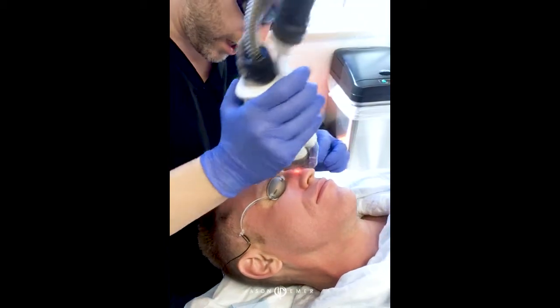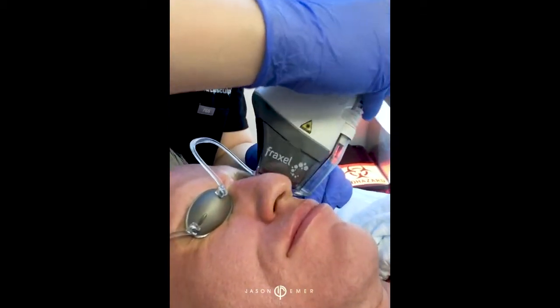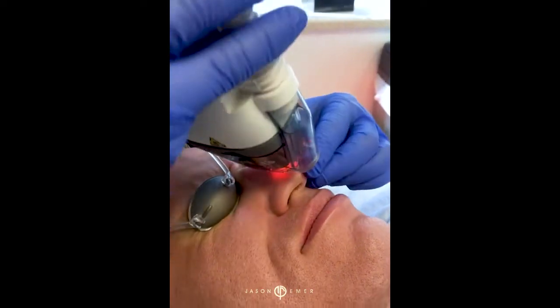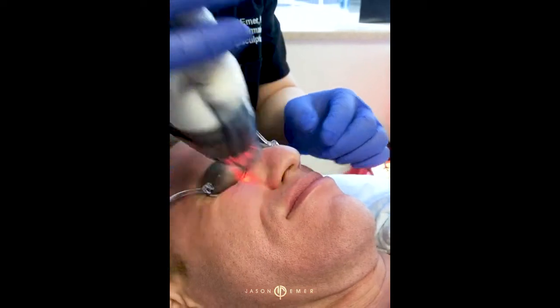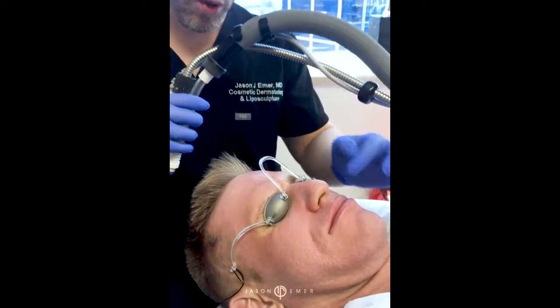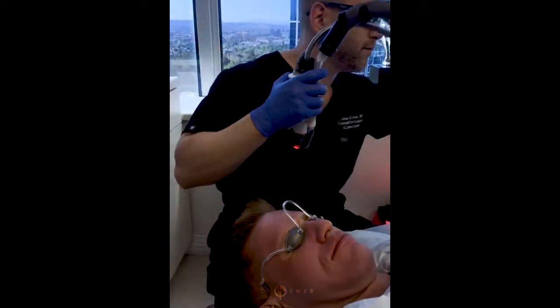All right, your chin down for a second. Now, let's do a little bit more over his nose. And then we're going to switch to do a little bit of Erbium resurfacing on top. What's that going to do? That's going to help us exfoliate more, help the pores more, and help any superficial scars. All right, guys, stay tuned.